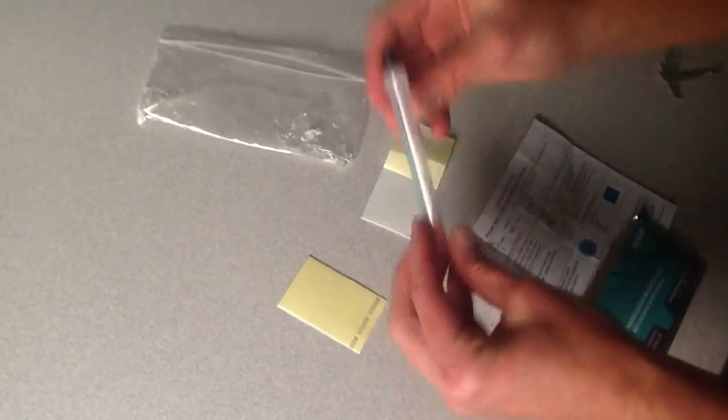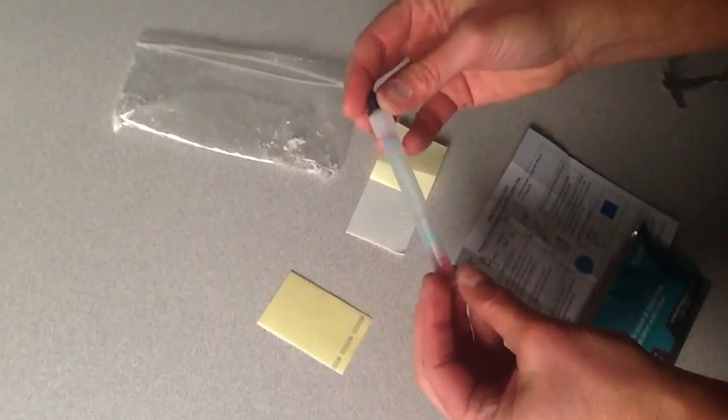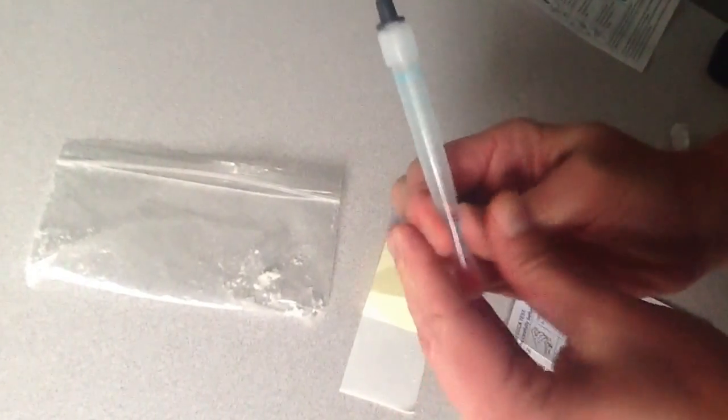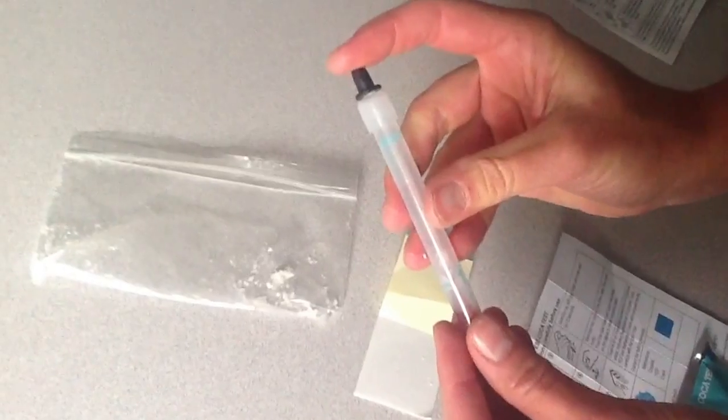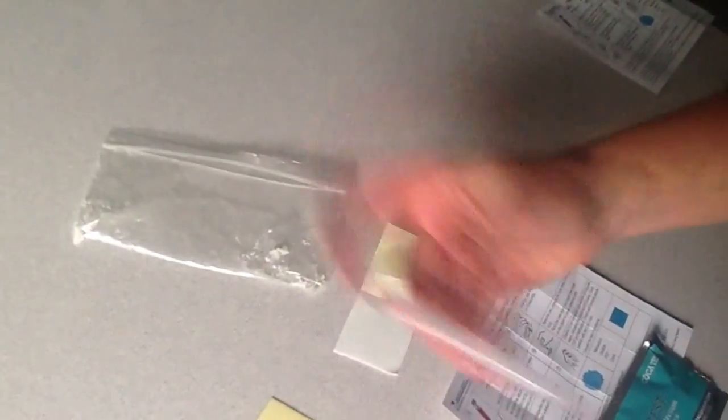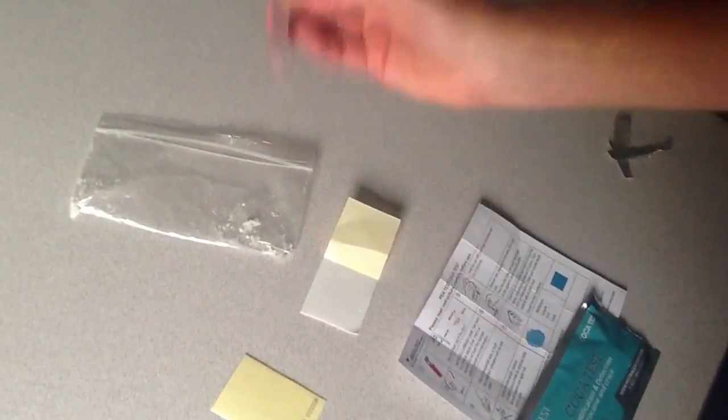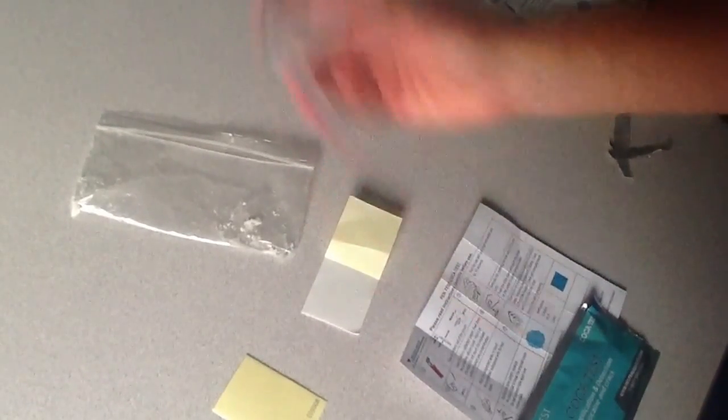Then set your collection paper down and take the pen. Hold the tube upright and squeeze the plastic tube to break the ampoule inside to release the test fluid. Hold the cap with your finger and shake well for ten seconds. Make sure you shake it for ten seconds.